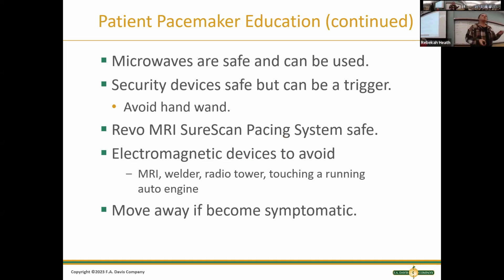It is true, there are specialized magnets that we do put over pacemakers that suspend the pacemaker from working. That's how we're able to check to see what the heart is doing when the pacemaker isn't going. You never want to put that on without a doctor's order, and usually with a provider there with you or somebody who knows what they're doing. But usually in most facilities, they'll have a pacemaker magnet somewhere. You can ask if they have one. They're big, they're heavy. Don't ever put them on your patients without asking. But that way you can see what the rhythm is without the pacemaker.